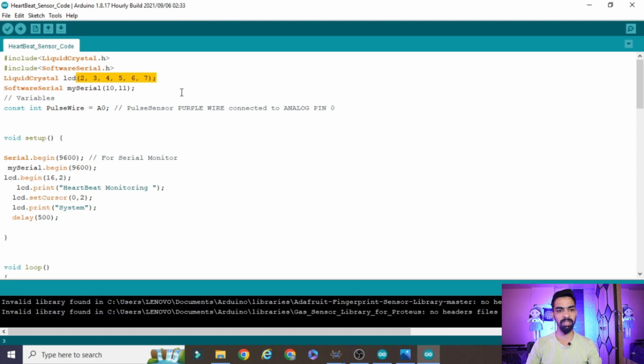Whatever the LCD connection pins are, they are defined here, so that's why it is giving 2, 3, 4, 5. Pin 2 is the RS pin, pin 3 is the Enable pin, then 4, 5, 6 and 7 are D4, D5, D6 and D7. Whatever pins we have used are defined here. Then for SoftwareSerial, the GSM RX and TX pins are connected to pins 10 and 11, so that is defined here. Then you can see pulse wire is analog 0, because we have connected the pulse sensor to the analog 0 pin of the Arduino.